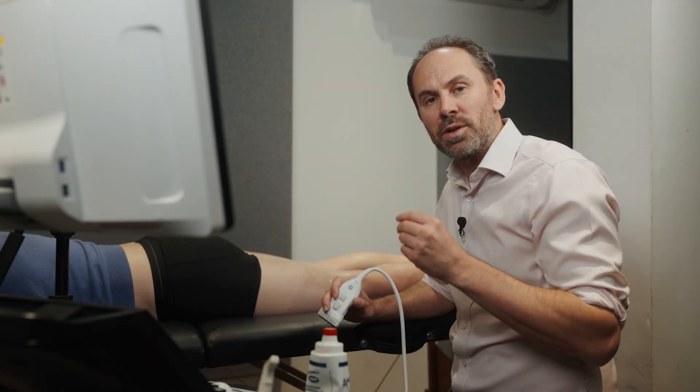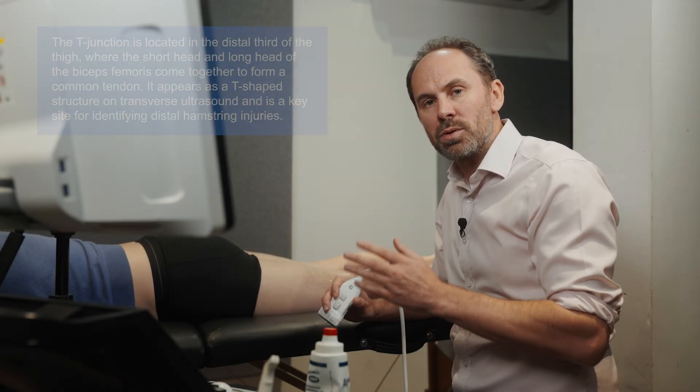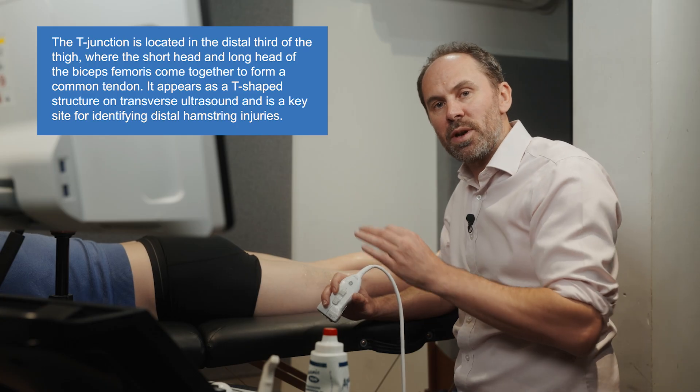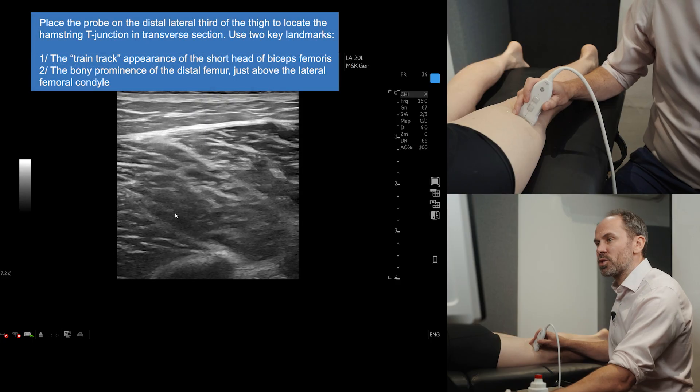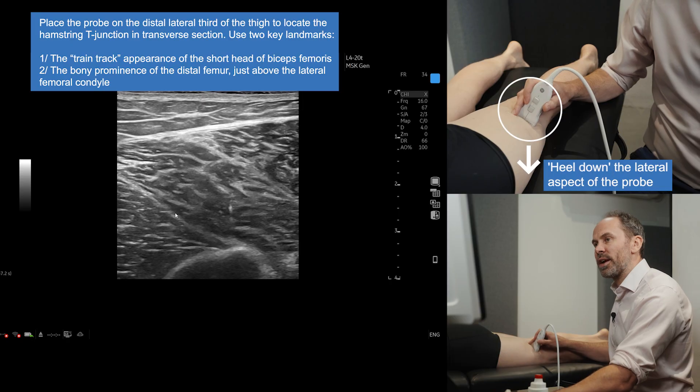Now we're going to scan the hamstrings. We're going to look at the T-junction area between the short head and the long head of biceps, which is an area where you can get a lot of injuries. So all you need to do is just place the probe in a transverse section and look for these train lines.